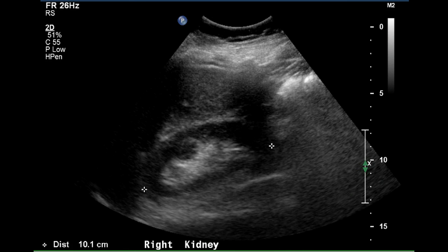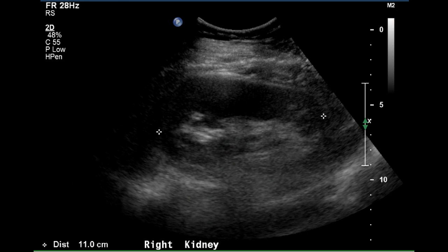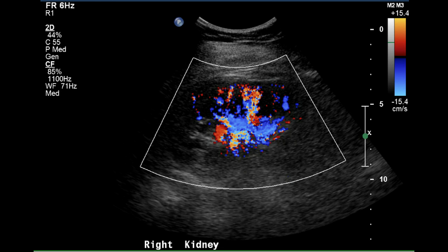The length of the right kidney is 10.1 centimeters, although this length may be foreshortened by shadowing from bowel gas. Color Doppler demonstrates some of the branches within the right kidney. This image of the right kidney, taken through a posterior approach, demonstrates the length at 11 centimeters, which is a normal length, and it is easier to visualize the individual branches within the kidney on this image.